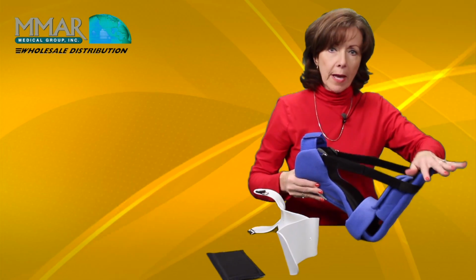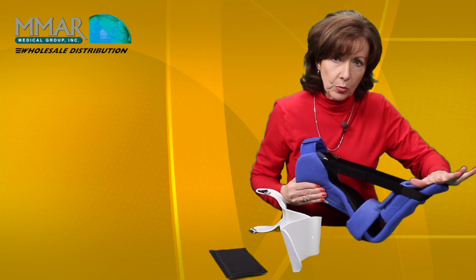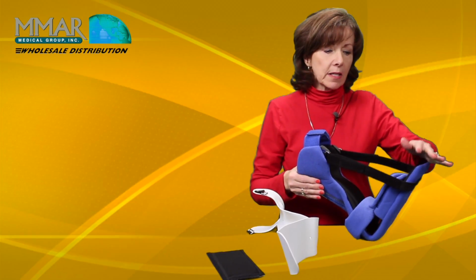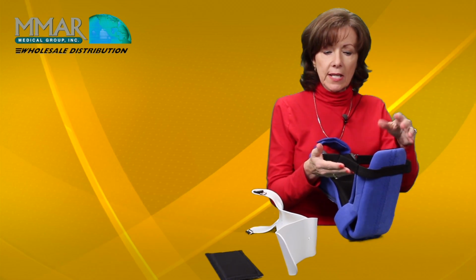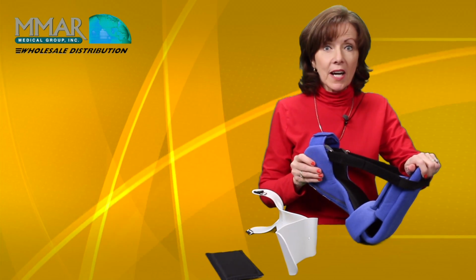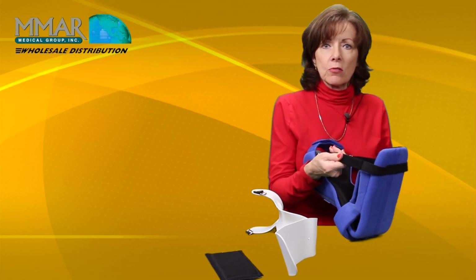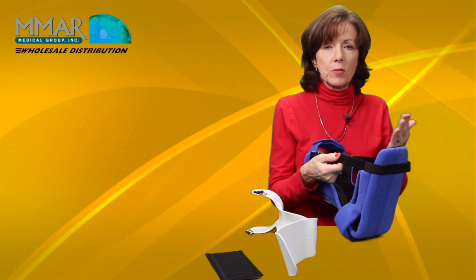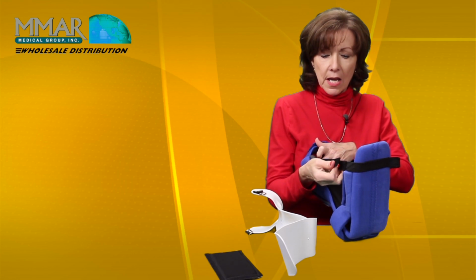Now, your straps have elastic properties, and your patient is going to be able to work through their tone with that tension that brings them back. And as I said, in about 15, maybe 20 minutes, you should see that relaxation. Sometimes that can have a profound effect on the rest of their body, so it's very important to allow them to go through that process. Don't just pull them up so tight that you feel like you're going to be able to correct them. You can't just shove their feet back up. But you do want this snug.